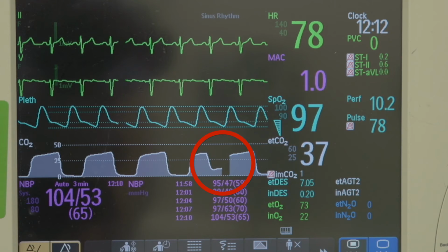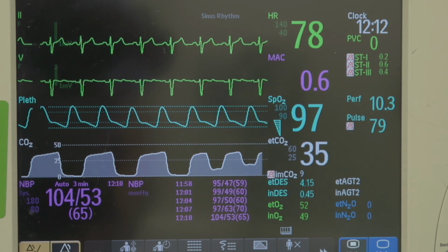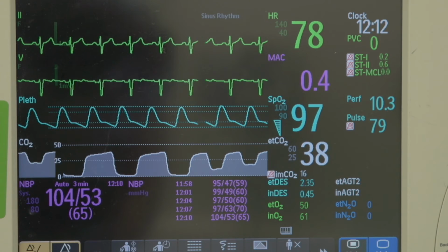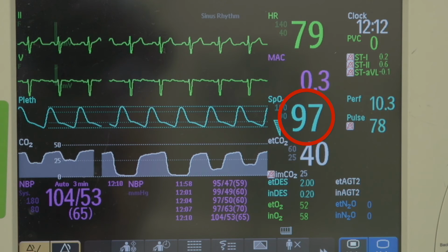the baseline waveform. Second, the fraction of inspired and expired oxygen will initially show a small initial drop due to introduction of room air that was contained within the ANEclear rebreathing loop. This short drop in the fraction of inspired oxygen, FiO2, should not be a major concern as long as oxygen flows have already been increased and monitored blood oxygenation remains adequate.